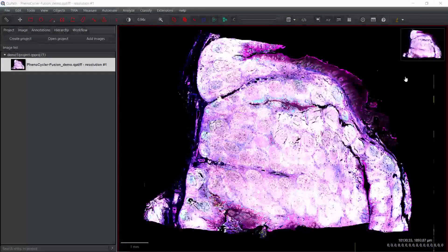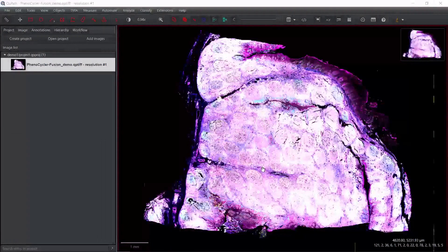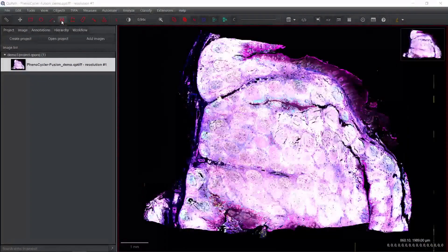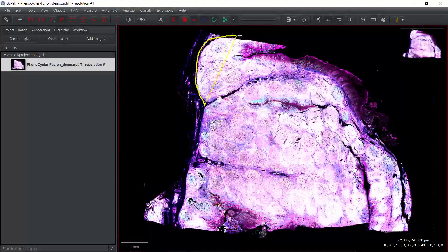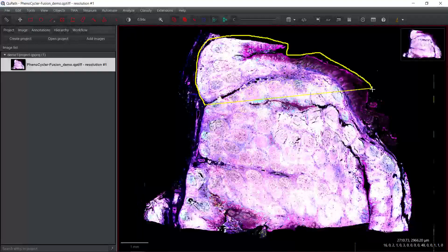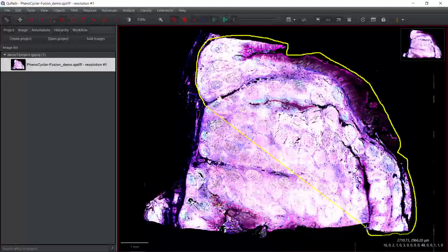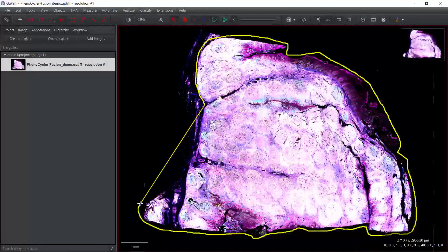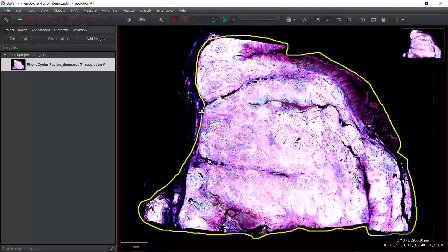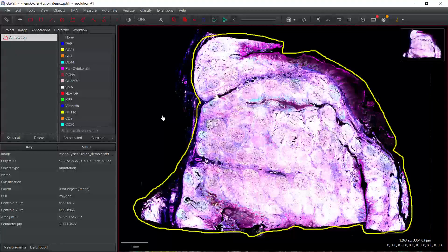Because I'm going to show you how to perform the multiplexed analysis on the whole tissue today, so first we need to perform cell segmentation for the whole tissue. We can use the Polygon tool to select the whole tissue. We selected the area we want to perform the analysis. Now we can have a look at the annotation. You can see this is the area we want to perform the analysis.